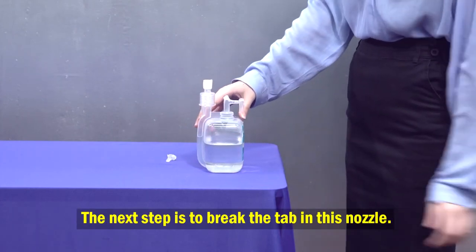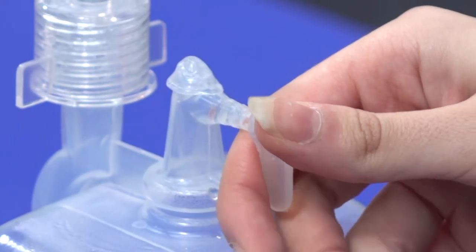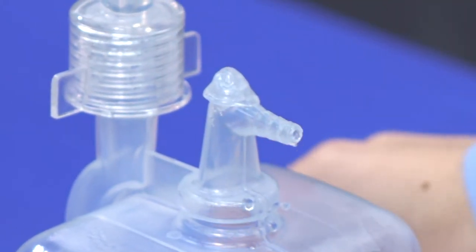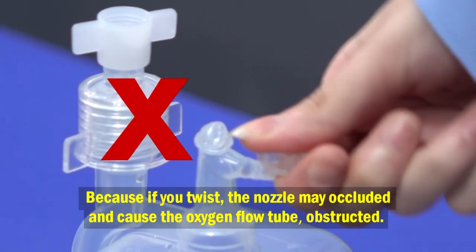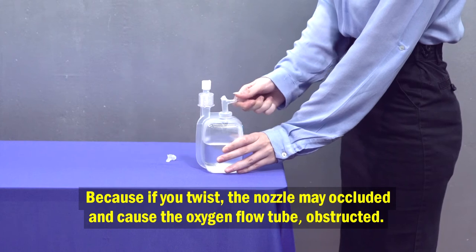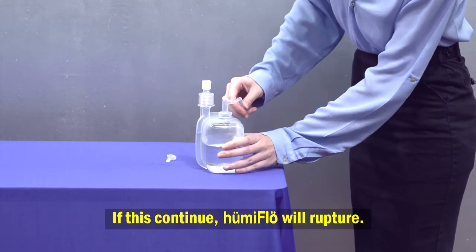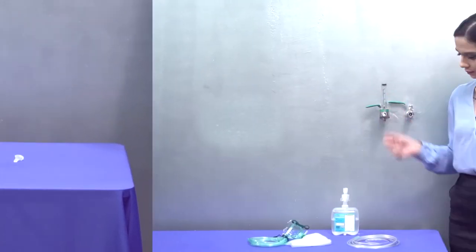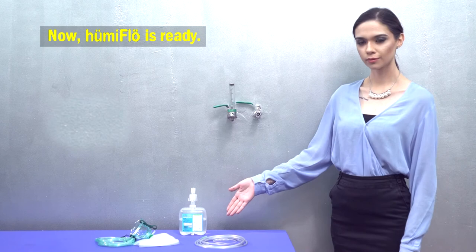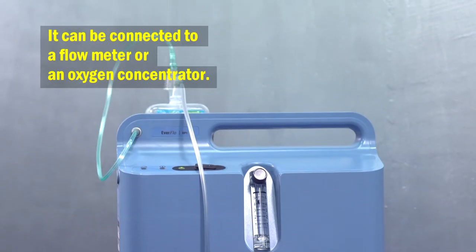The next step is to break the tab on the nozzle by pulling it upwards. Do not twist, because if you twist, the nozzle may become occluded and cause the oxygen flow tube to be obstructed. If this continues, Humiflow will rupture. Now Humiflow is ready and can be connected to a flow meter or an oxygen concentrator.